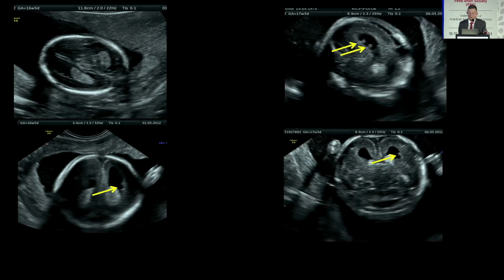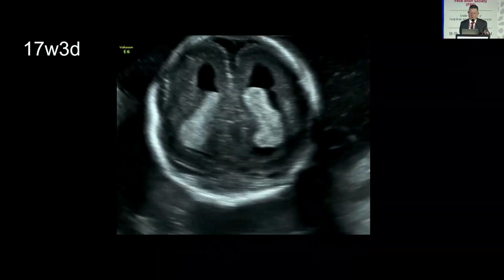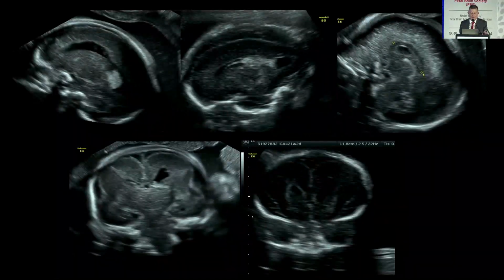So these were the still images. And this is the case I show you, early presence of heterotopia. This is one of the few routine examinations I did, and I found something. You see here these two small lobules. I said, no, it's not possible. They cannot be there. Perhaps it's some kind of bleed. I called the patient back in 2 weeks, and they were still there. And look how difficult it is to see, because if you move, you may miss them. Hop!